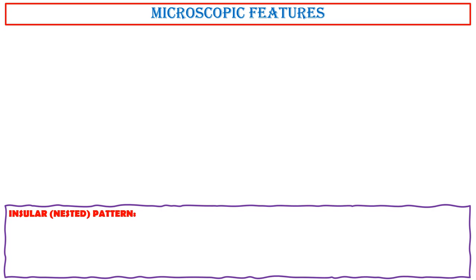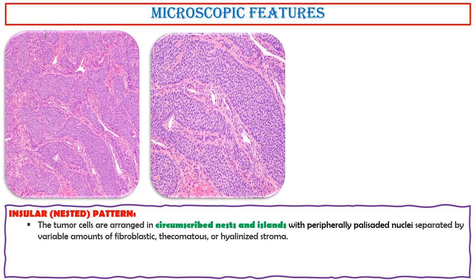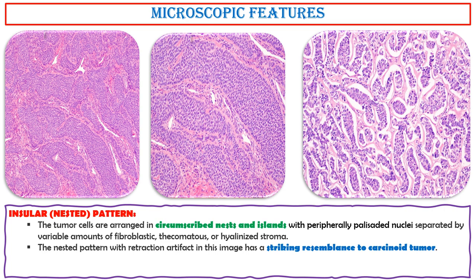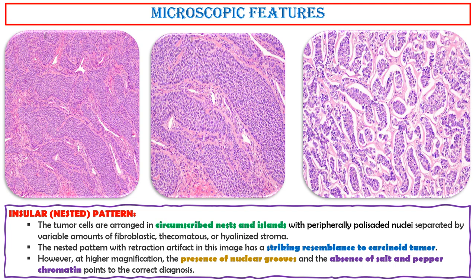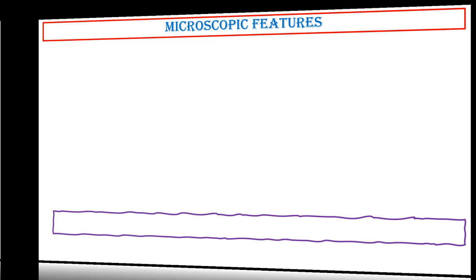Insular nested pattern. The tumor cells are arranged in circumscribed nests and islands, with peripherally palisaded nuclei separated by variable amounts of fibroblastic, thecomatous, or hyalinized stroma. The nested pattern with retraction artifact has a striking resemblance to carcinoid tumor. However, at higher magnification, the presence of nuclear grooves and the absence of salt-and-pepper chromatin points to the correct diagnosis.